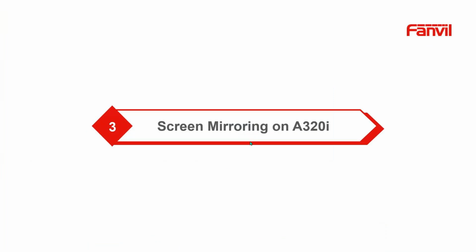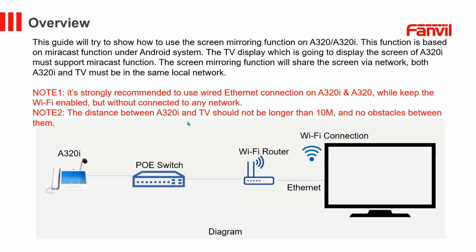Now let's see the screen mirroring on the A320i. Screen mirroring is a valuable feature on the A320i, allowing the nurse station to share its screen with a compatible TV display. This is done via Miracast, ensuring that all devices are on the same network.